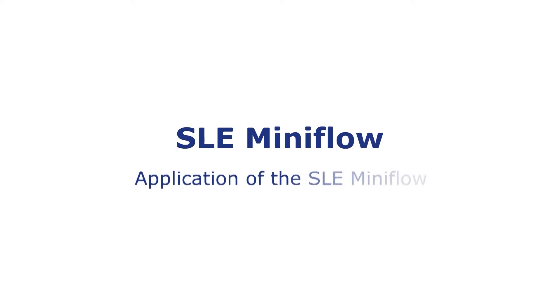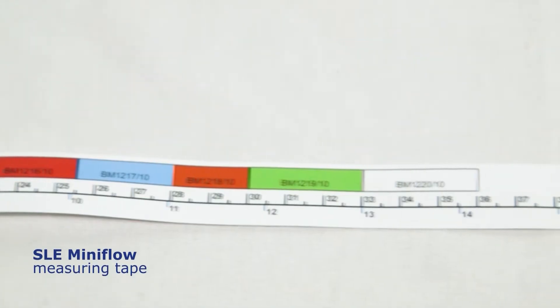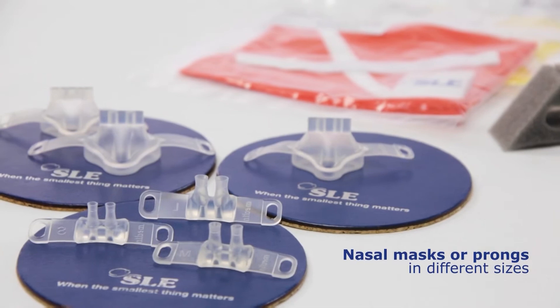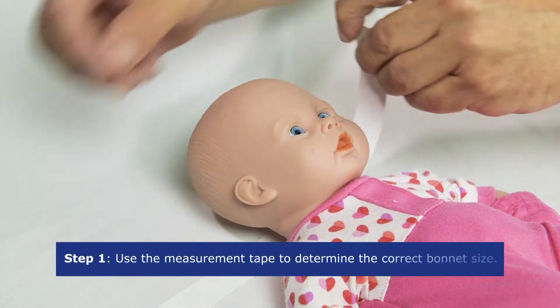For the application of the SLE MiniFlow, you will need a selection of bonnets of different color-coded sizes, an SLE MiniFlow measuring tape, masks or prongs, a fixation pillow, fixation straps, and an SLE MiniFlow generator. Firstly, use the measuring tape to determine the correct bonnet size.